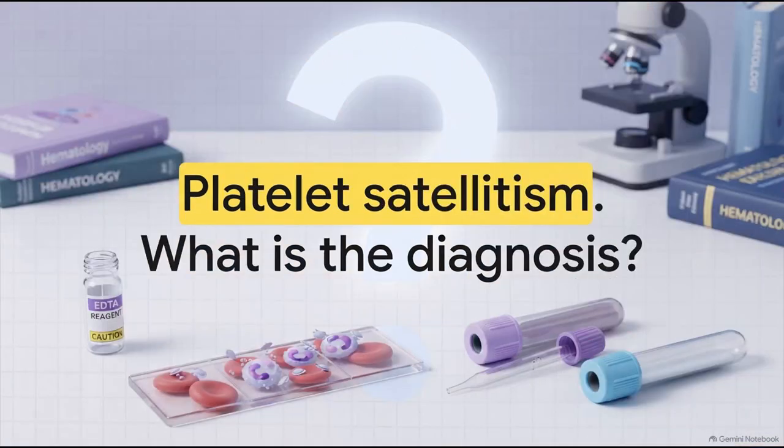Last piece of evidence, you see platelets swarming and sticking to the outside of neutrophils, platelet satellitism. What terrible disease is this? Actually, scratch that. It's a trick question. It's just an EDTA artifact causing pseudo-thrombocytopenia. Your diagnosis is a lab error. Just redraw the blood in a citrate tube.